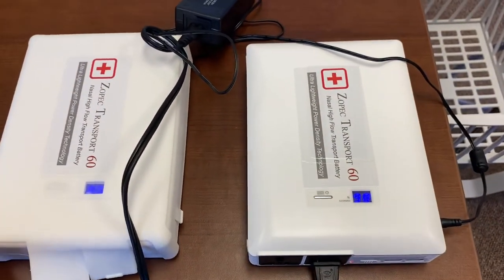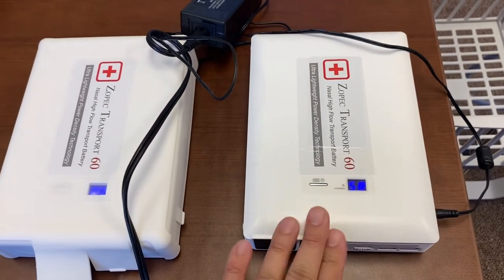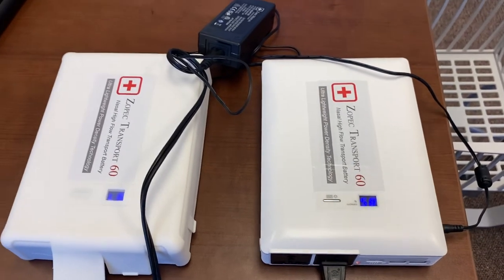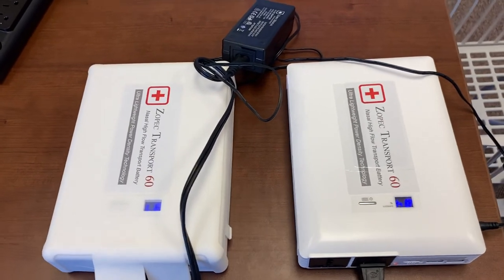If you start with both at 100%, you will see both start to drain — and that's how you link the batteries. If you need more hours, you can simply link more batteries.